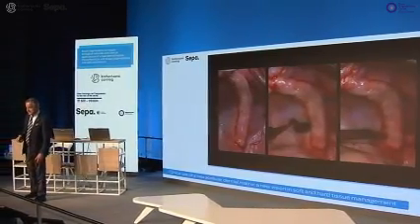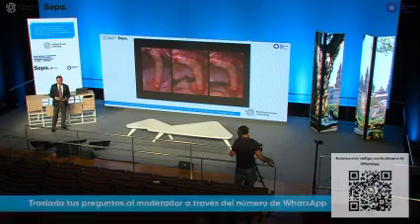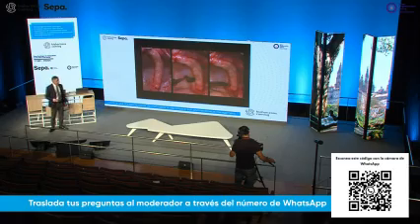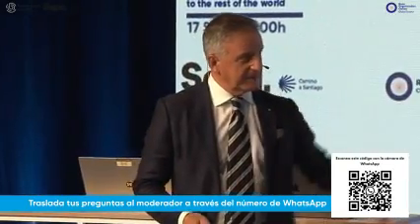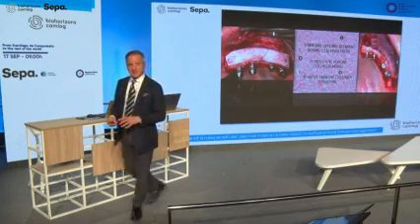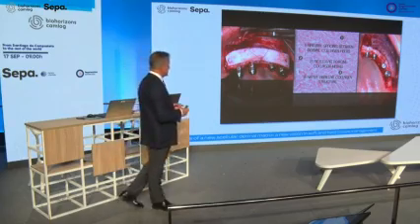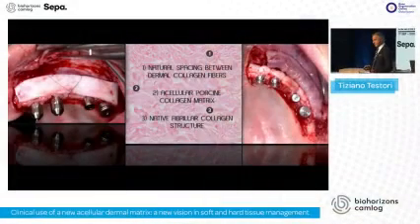And this is the type of flap that we use for uncovering implants in the upper jaw, achieving 3 goals, reestablishing the depth of the fornix, done by this procedure. And on top of that, placing on one side and on the other side a long chunk of Novomatrix that thickens the tissue and makes the tissue more stable.